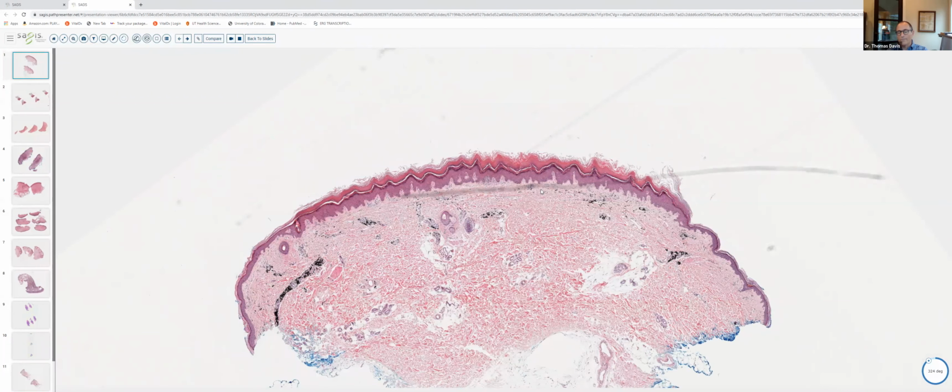And what we have here is a hypertrophic scar. And then if we take a look at this piece, let me go ahead and get rid of that diagram there. What you see is we have these large accumulations, almost lakes, of this kind of bubbly, feathery, amorphous, somewhat granular pink to blue material. And this is intralesional Kenalog, or intralesional steroid, which was injected into a hypertrophic scar.